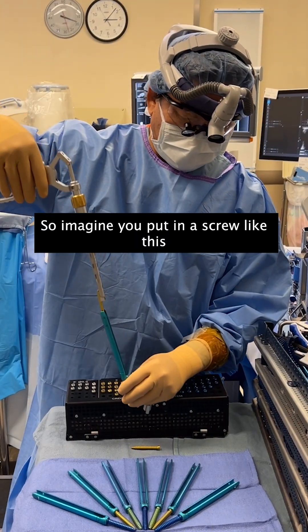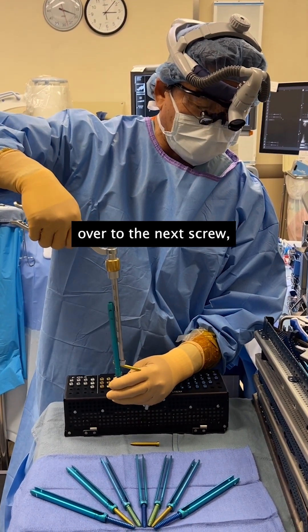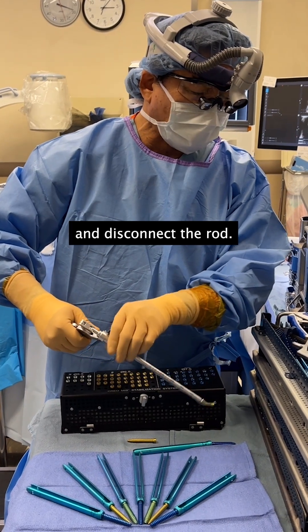Imagine you put in a screw like this, and then you kick it over to the next screw, and then you unscrew it right here and disconnect the rod.